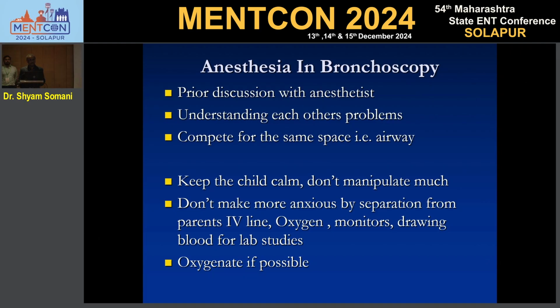I am here to present a talk on rigid bronchoscopy, and I will demonstrate a few of the things on the rigid bronchoscope. So coming directly, because it is a skill development session, we are not going to see any theory part. We are going to directly see the practical part and how things go with rigid bronchoscopy.